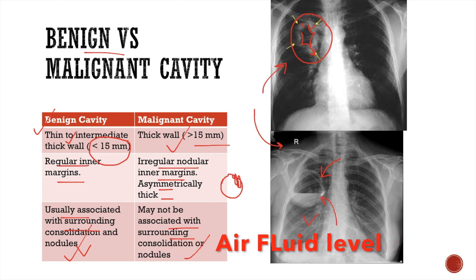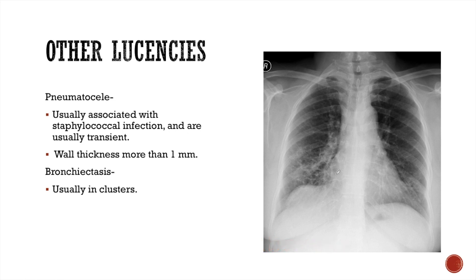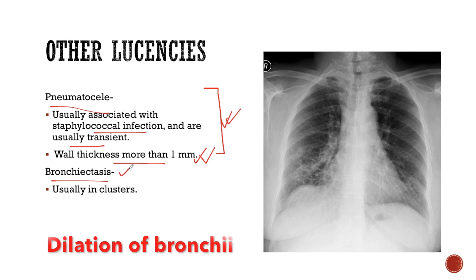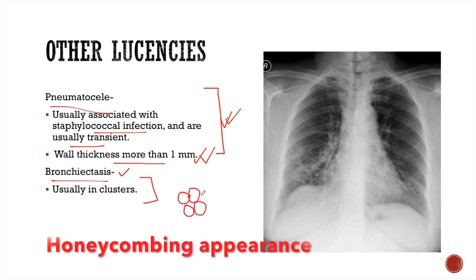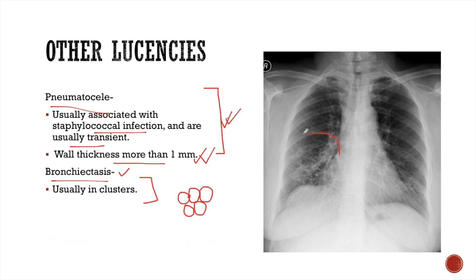There is also an air-fluid level within the cavity, which suggests this benign cavity lesion is an abscess. There may be other lucencies on an X-ray as well — those are pneumatoceles and bronchiectasis. Pneumatoceles are usually associated with staphylococcal infection and are usually transient, with wall thickness of more than 1 mm. It may be very difficult to differentiate pneumatoceles from a benign cavity lesion. Bronchiectasis is characterized by dilatation of the bronchi, usually occurring in clusters, creating multiple lucencies that form a clustered honeycomb appearance on X-ray. For example, in this X-ray we can see multiple lucencies clustered together forming a honeycomb appearance — this is a case of right middle lobe bronchiectasis.